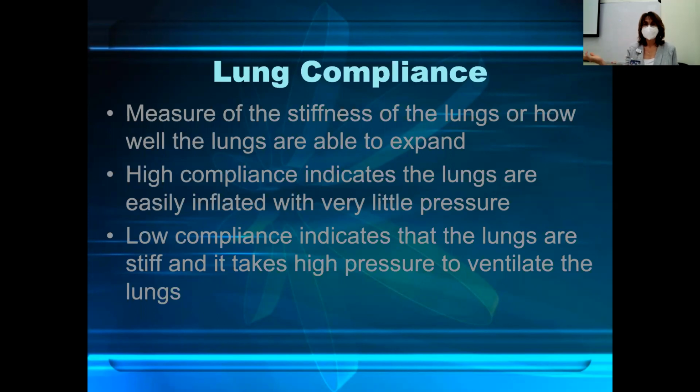So high pressure to ventilate somebody that has stiff lungs. What's another name for stiff lungs? High compliance or low compliance? Low compliance. Yes, very good. So stiff lungs, low compliance.